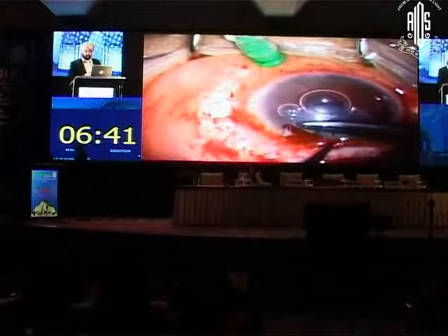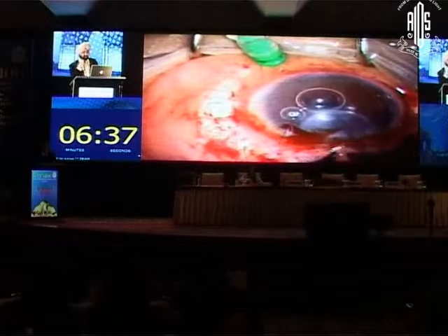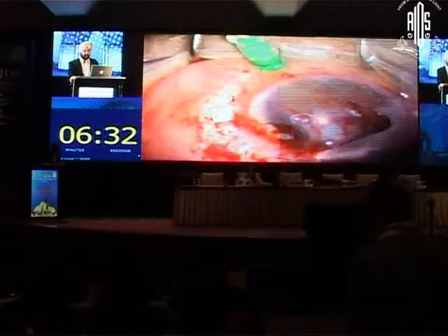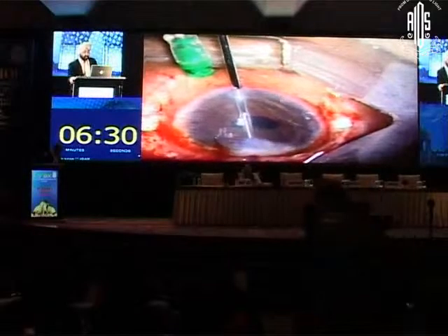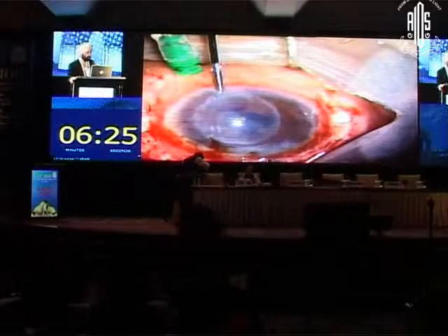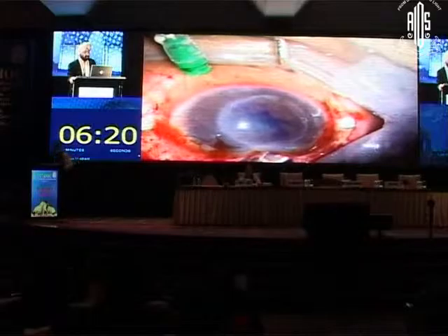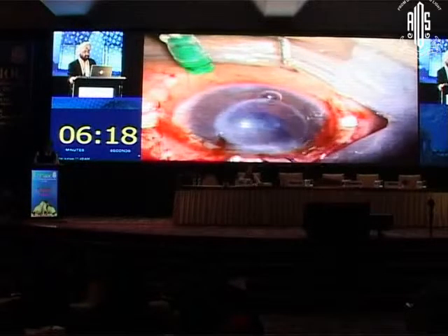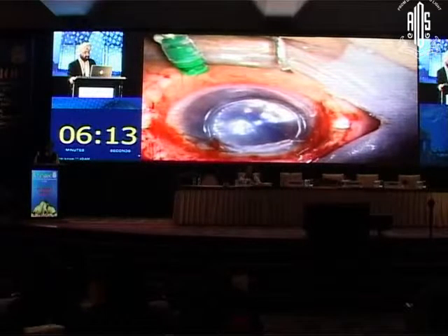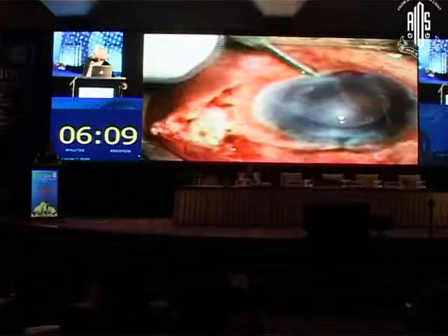So what we do is go ahead and put a suture in this particular case. See, that's an expulsion of the lenticule. We again hold the lenticule and pull it back into the eye. And the infusion is off, but despite the infusion being off, you can see that the lenticule is still on its way out. So we put air. Once we have put air, we try to then put the sutures, and post-operatively we observed that there was hemorrhage.